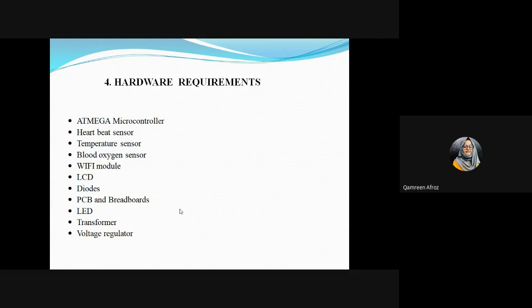Now coming next to the Wi-Fi module, that is the ESP8266 module we are using. This Wi-Fi module will be connected to Arduino. We will use the software serial port; the hardware serial port will be available for programming, uploading and debugging. This Wi-Fi serial transceiver module is based on ESP8266, and it is of small size and low cost, which makes it suitable for sensor nodes.